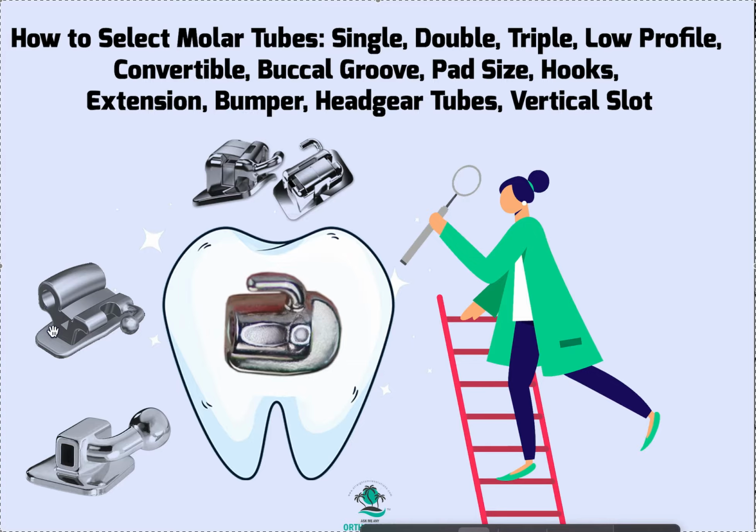A convertible just means that this part of the tube you got here, you can peel it back with this little can opener thing. It basically has the ability to be converted from a 4-sided thing to a 3-sided thing. Don't worry, you're not going to do that. You're definitely not doing that.